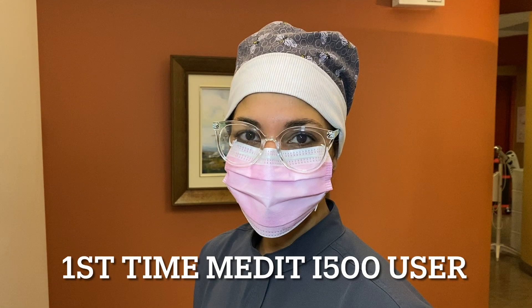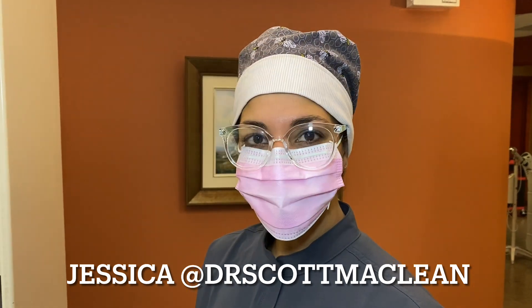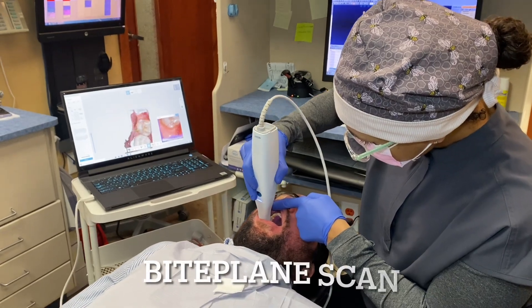Hi there, it's Dr. Scott McLean and this is my lead dental assistant Jessica. She's about to try the Medit i500 for the first time. She has had scanning experience but no training on the Medit i500 at all. So let's check in on her and see how she's doing.